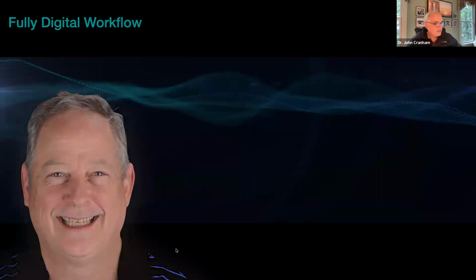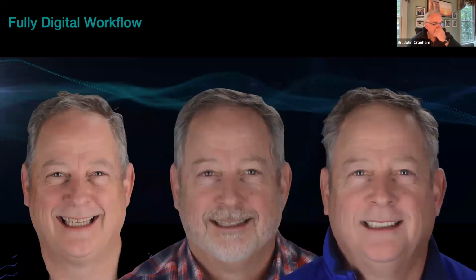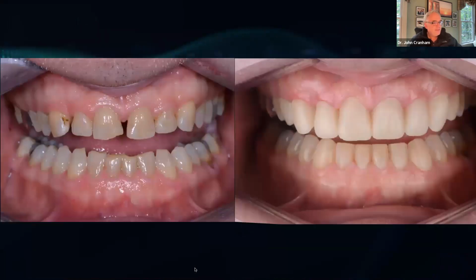And once it's in the mouth, just like in the analog world, we'll start studying it. Again, this patient's been equilibrated now. I've done bonding on the lower edges. We've got a provisional one up top. And we can start to see the transformation from pre-op to post-ortho to now provisional restorations. And that's starting to really take shape. This shows you what we did at the lower incisal plane with our bonding. So those will be long-term temps. They're not splinted. Those are individual bonded restorations.